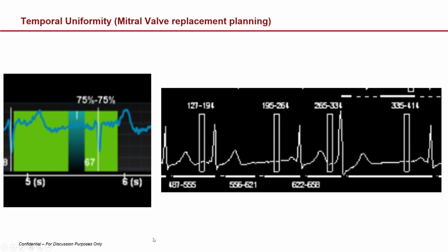Now, the reason that this worked so well in this example is because this patient had a pretty substantial arrhythmia. So if you look here, we have this very fast heartbeat and this slow heartbeat and this fast heartbeat and this slow heartbeat. And when you're looking at diastole, it all needs to come from a similar size and shape heart. And each one of these represents approximately 3 centimeters across on the Z-plane, right? And so if you look here from this R peak to this R peak, 70% of that diastolic phase is essentially at the end of that ST segment, essentially in systole.